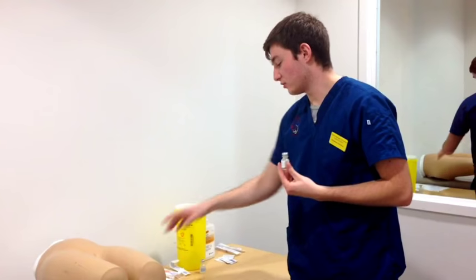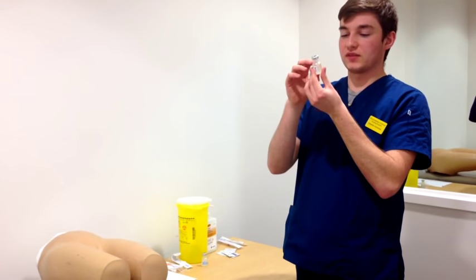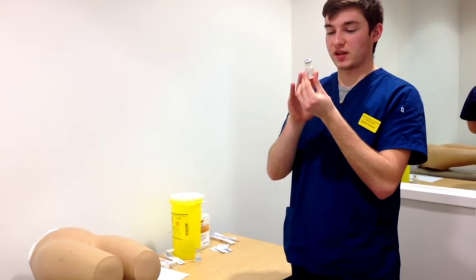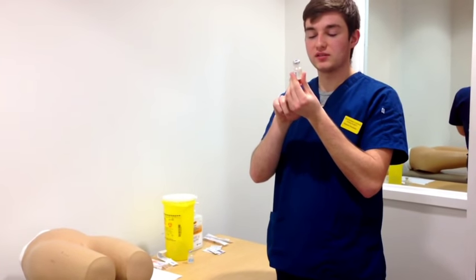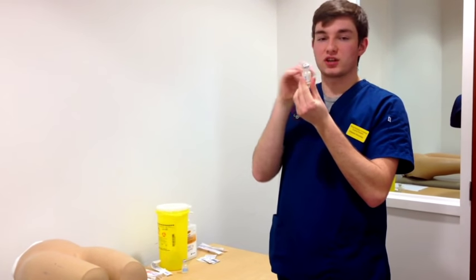Next, I'll grab Haldol from the machine, again making sure it's for the right patient on the MAR. I grabbed it from the AccuDose. Again, I'm checking the MAR, making sure it's the right medication. For Haldol, the supply is 4 milligrams per 2 milliliters. I'm going to make sure this is 4 milligrams per 2 milliliters, appropriate, again checking the expiration date.